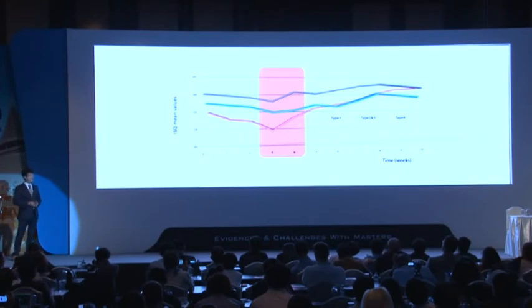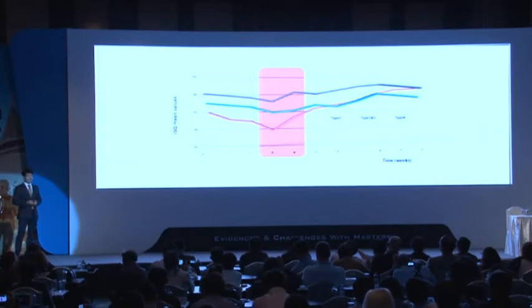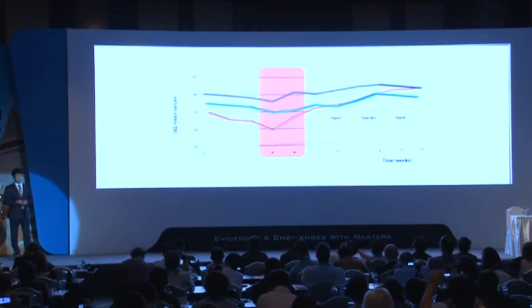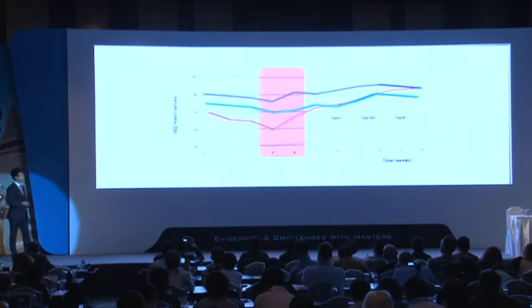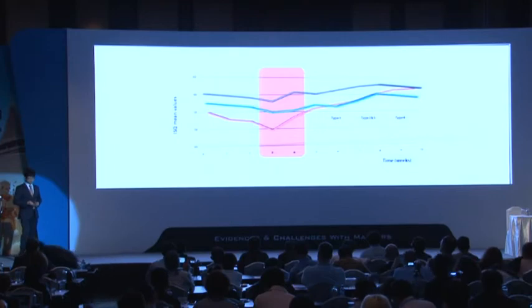According to many articles, implants showed the weakest anchorage and the lowest ISQ value in the first 3 weeks. And ISQ values show some fluctuations until 6 to 8 weeks, and then ISQ values were restored 8 weeks post-surgically. So this kind of graph can be found in most implant systems. Then what about ISQ values of Anyridge?